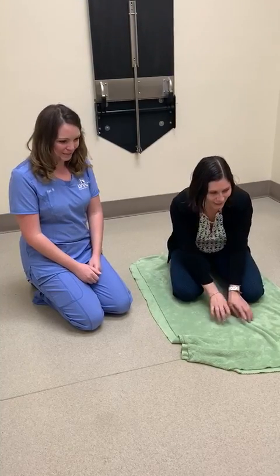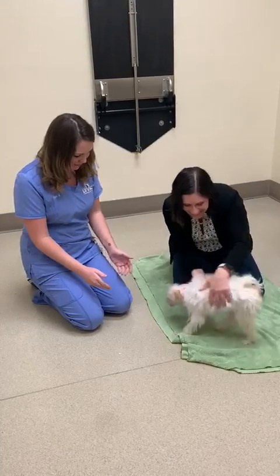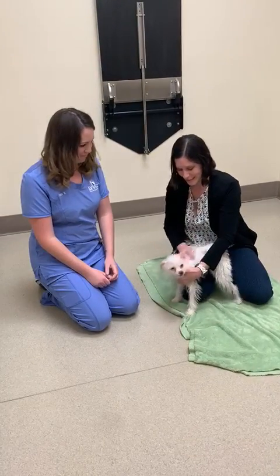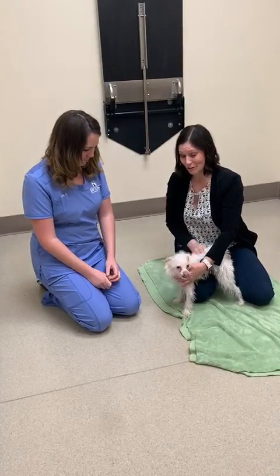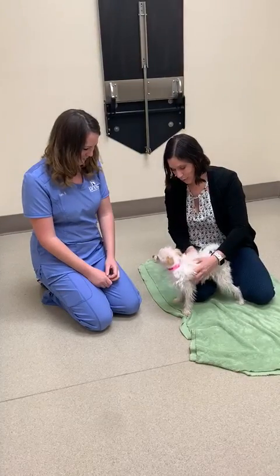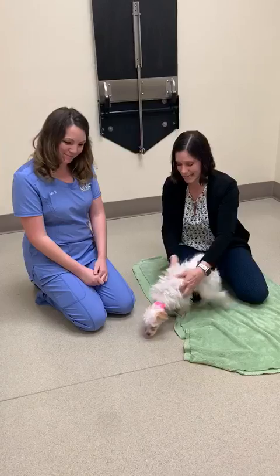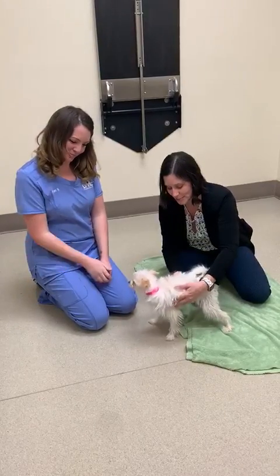This is Clover. She's a little rescue puppy that needs a B12 shot, so she's going to be our demonstration — this is a shot she already needs. So what we're going to do is show you some different ways. If you have a helper at home, this is Ayana — she's going to be our helper today, she's one of our assistants.